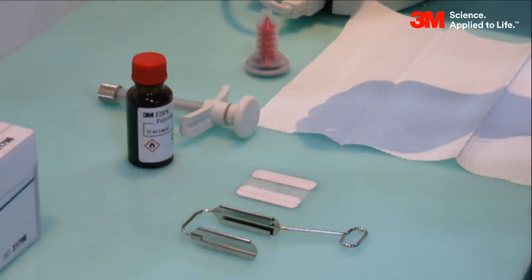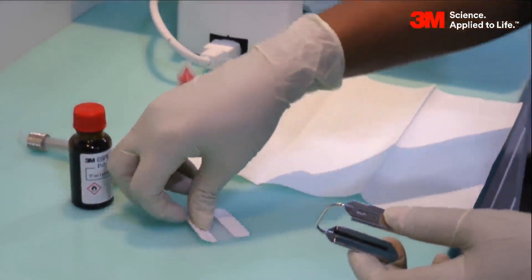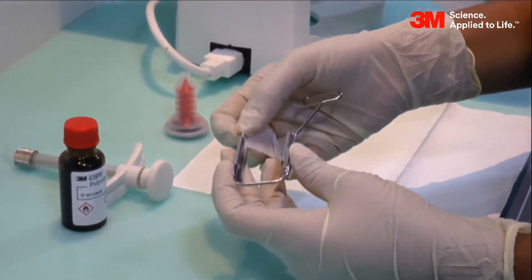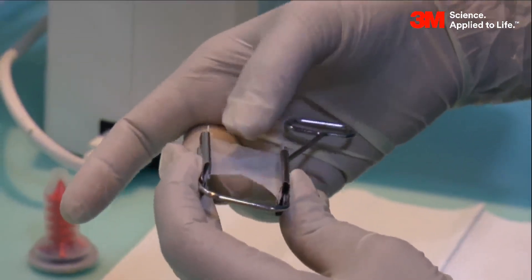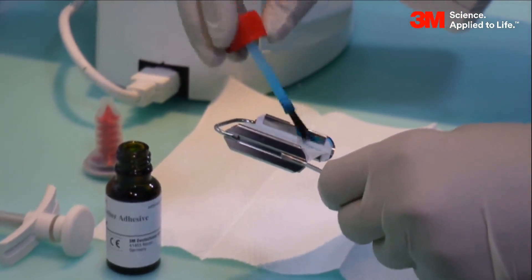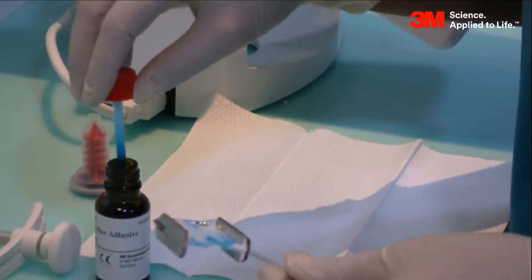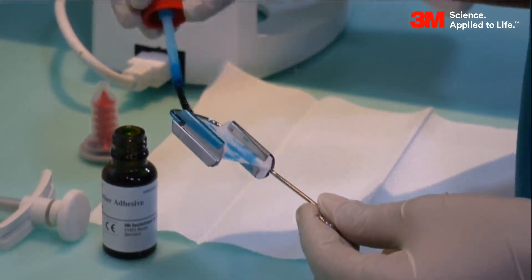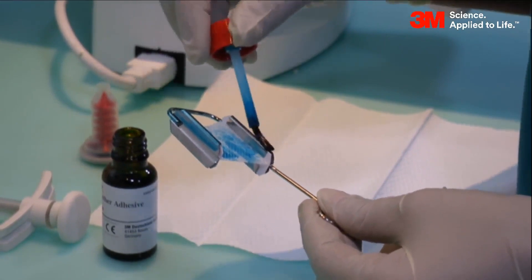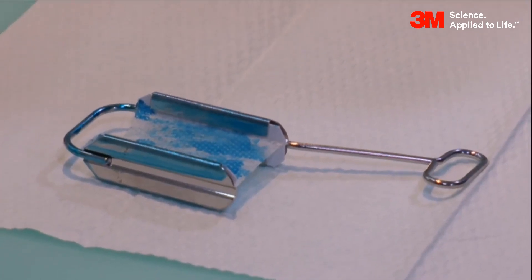Preparation for the impressioning technique. The materials used here are: 3M poly ether tray adhesive, 3M elastomeric syringe, triple tray, and 3M penta mixing tips. Take the triple tray and place the mesh in it. This is a reusable stainless steel triple tray. Apply 3M poly ether tray adhesive on all appropriate areas wherever the poly ether impressioning material will flow. Allow the poly ether tray adhesive to dry on the triple tray.